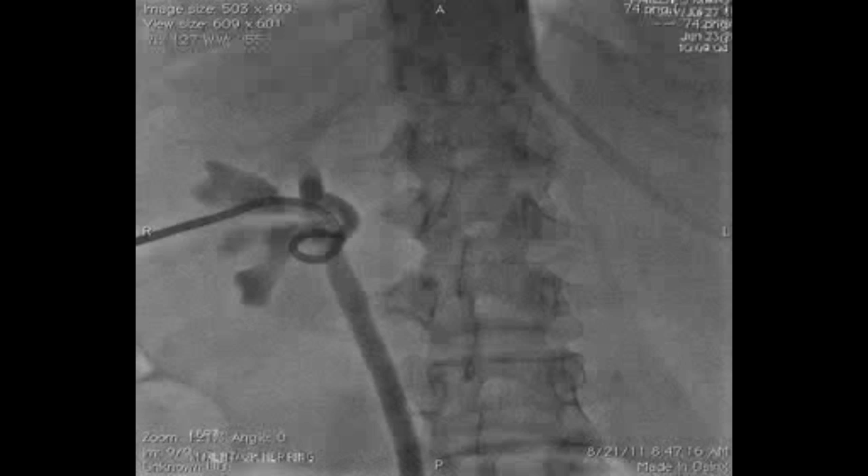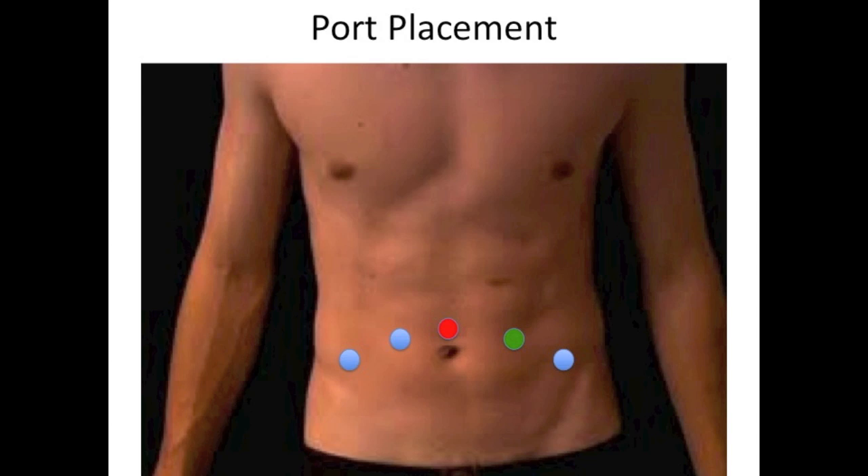Patient positioning can be in a low lithotomy position, with trocars placed in an umbrella-like fashion similar to robotic prostatectomy, including a 12-millimeter assistant port. Alternatively, patients can be placed in a modified flank position.